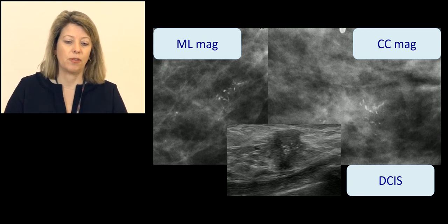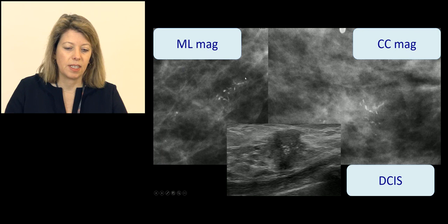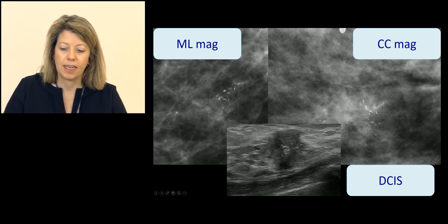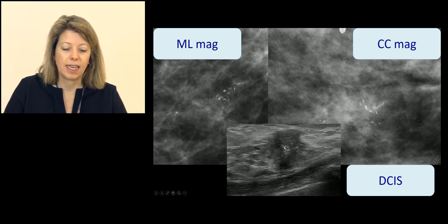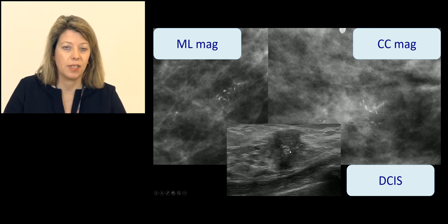Here is an example of a microcalcification cluster on mediolateral and craniocaudal views. On the mediolateral view, you can see irregular calcifications defined in a triangular orientation — this is typically a DCIS microcalcification cluster. On the CC view, the same irregular, dense calcifications are obvious and suspicious. On ultrasound, we detected these calcifications within a dense mass. It was a pure DCIS — not invasive — but sometimes you have the chance to see the calcifications on ultrasound.